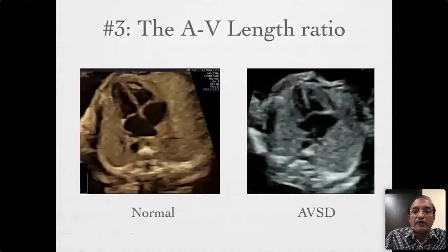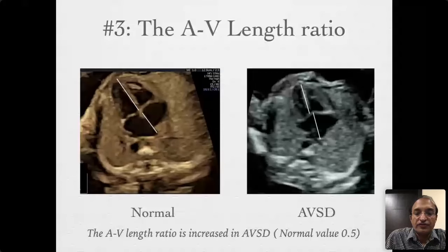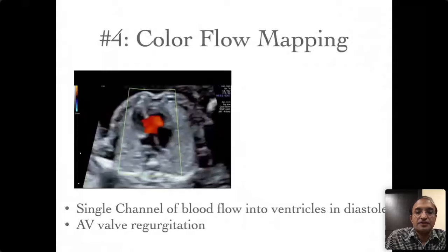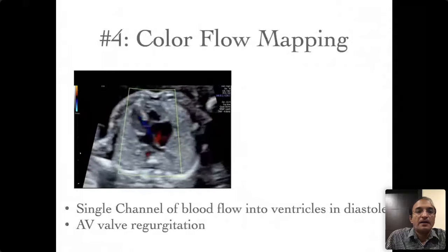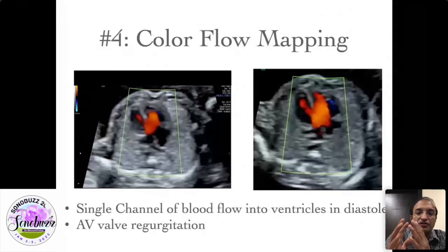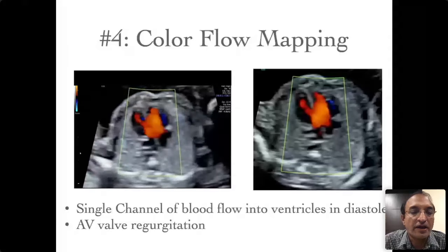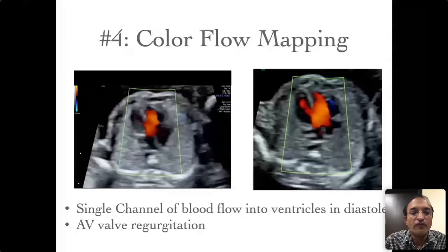The third feature involves the AV length ratio. Normally the ventricular length is greater than the atrial length, but in AV septal defect there is downward displacement of the valves, so the ventricular AV length ratio is increased. The fourth feature is that on color Doppler you find a single channel of blood flow into the ventricles instead of two separate channels, and you can also see atrioventricular valve regurgitation.